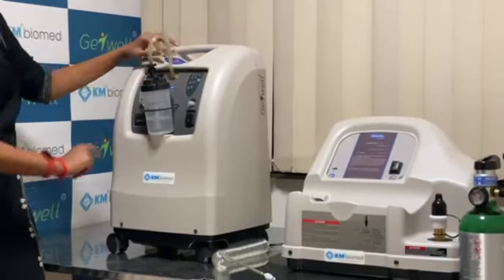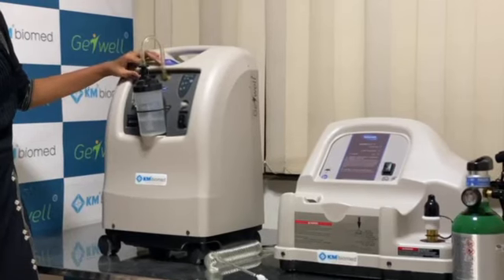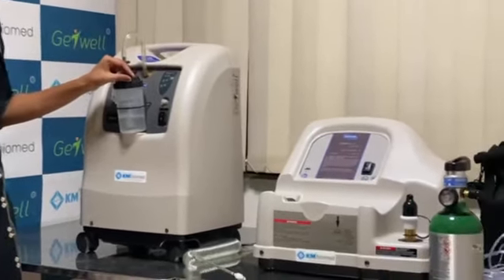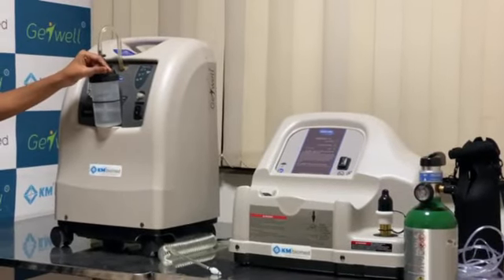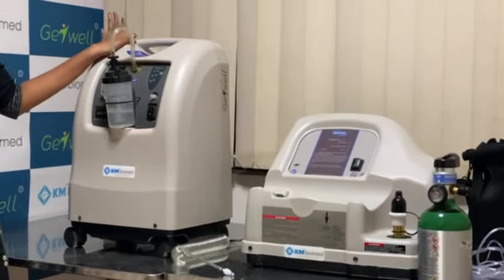This is the flow meter which ranges from 0 to 5 liters. We can also adjust the knob according to the doctor's prescription. Through this port, we connect the cannula tube, which goes to the nostril of the patient, and the patient can receive pure oxygen. This system has 95 percent purity of oxygen.